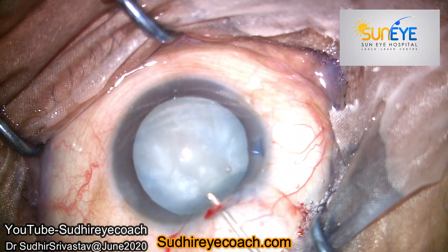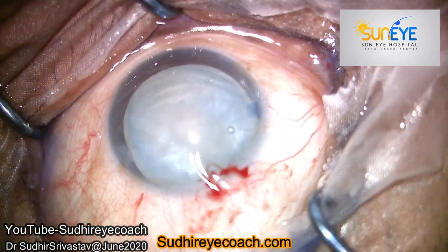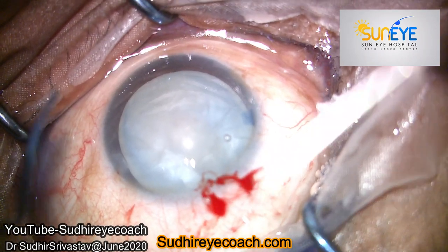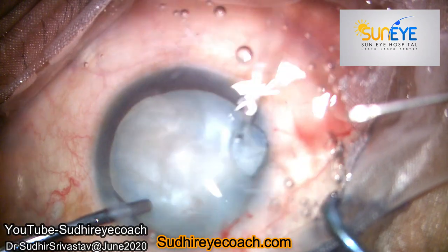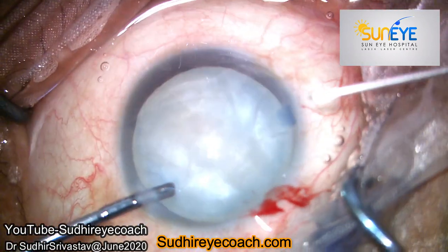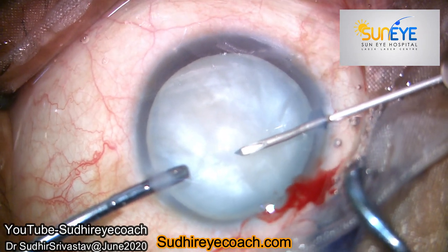I made two side port incisions and one 2.2mm clear corneal incision, and I stained the capsule with trypan blue dye. I filled the anterior chamber with high viscosity viscoelastics to give a good tamponade to the anterior capsule.